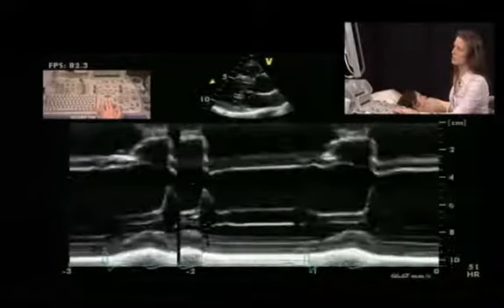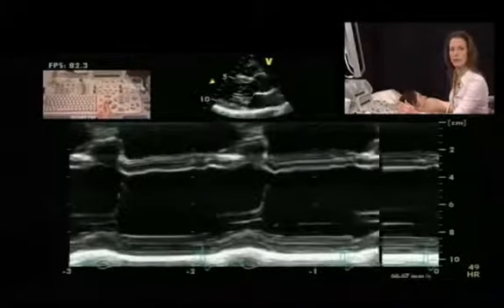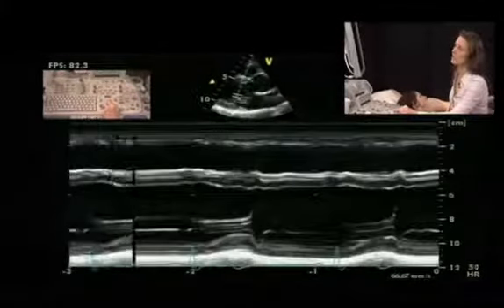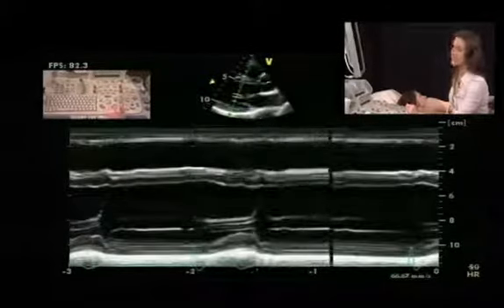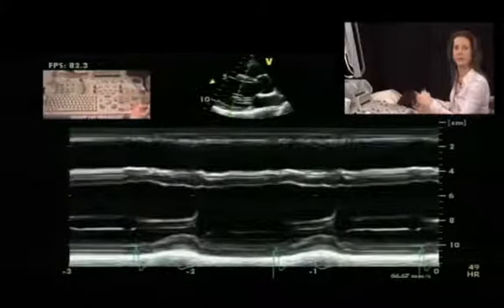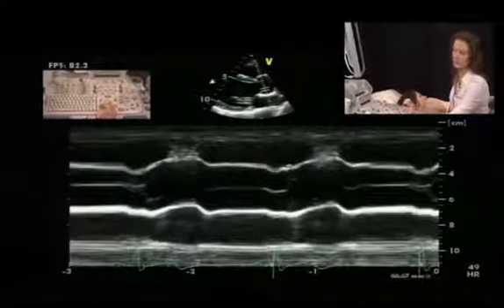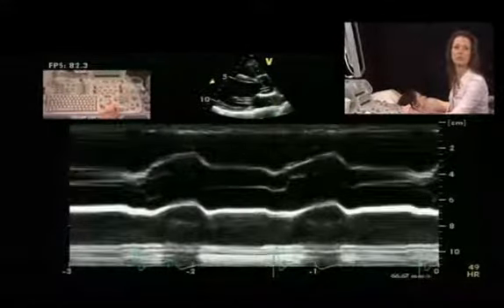You change the position, you have the small sample volume in the middle. This is to angulate, to define the angle. Just press the enter button, and then you can change it and make a real proper acquisition now. This can be done in the live scanning. You can also freeze the image, you make your measurement, and then you can also move the cursor even more. Go, for example, to another structure, aortic valve. Again, also adjust the angle, and you can do your measurements here.